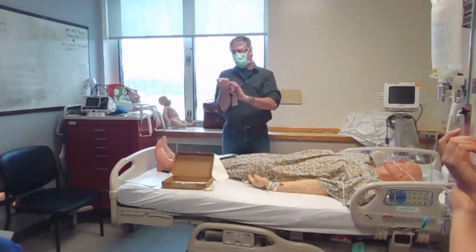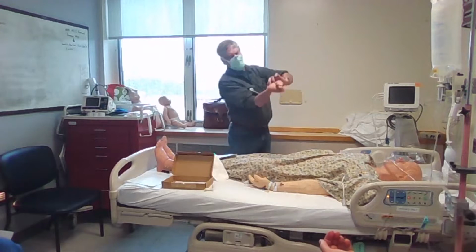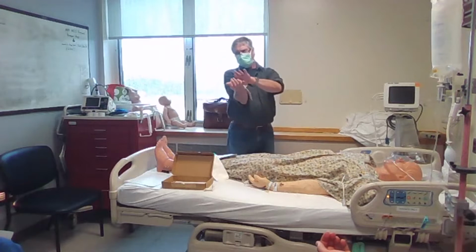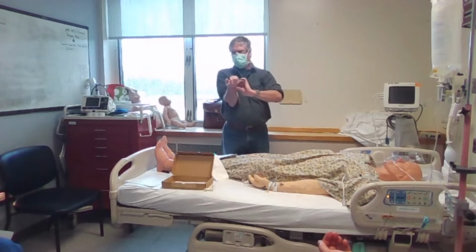So that's your radial. Your ulnar is a lot harder to feel, because it's a little bit deeper. But it's pretty much equidistant on the other side. And I tend to go a little bit higher up on the wrist because the arteries and veins are deep at that point and they come up to get through the bones of the wrist. So you can feel it there as well.